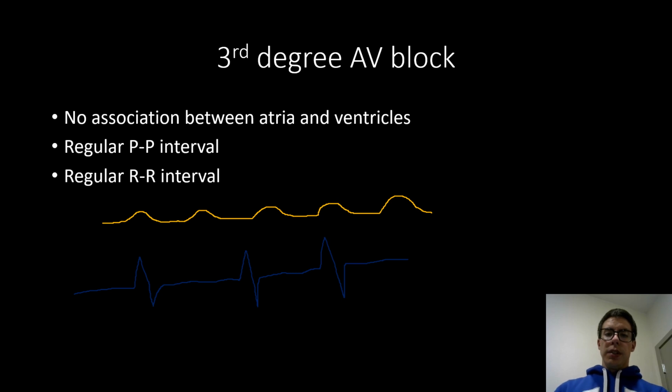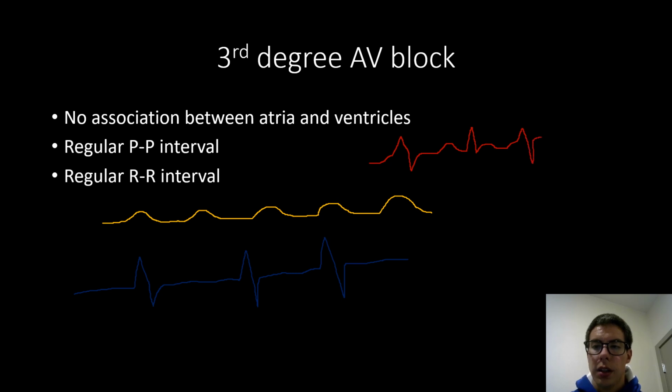Because we look at these two things and you have to remember that these are going to be combined. So really, what this would look like as the actual rhythm, I'll draw it up here in red, it would probably look something like this. Then that second P wave, then we'd have, I guess we'll kind of do that. So it would look something kind of like that.